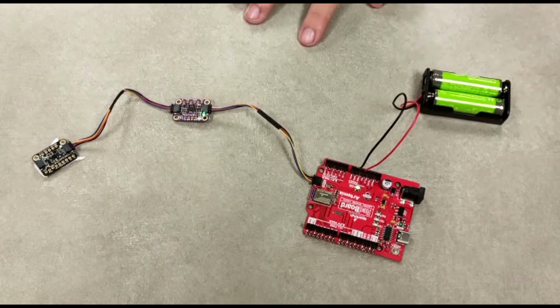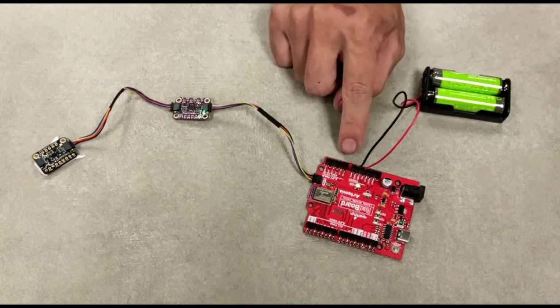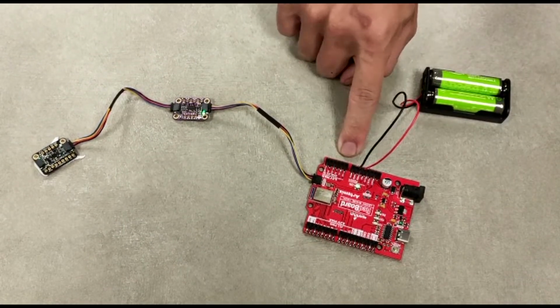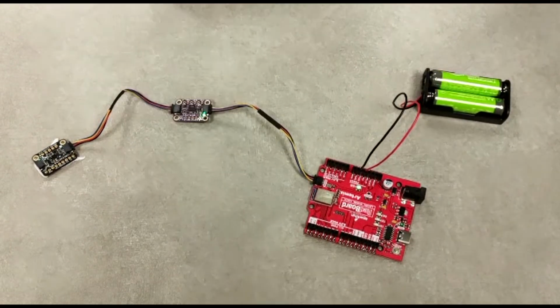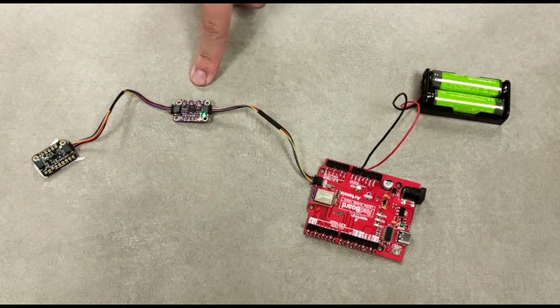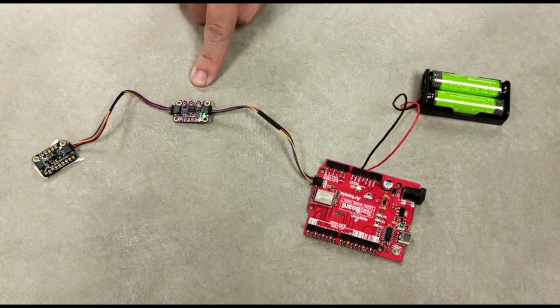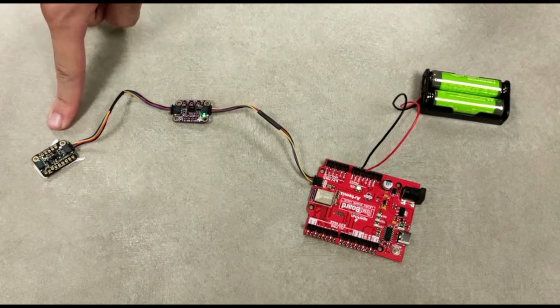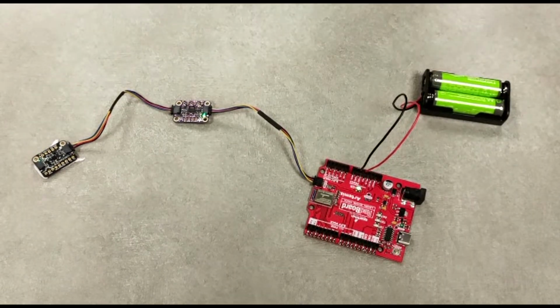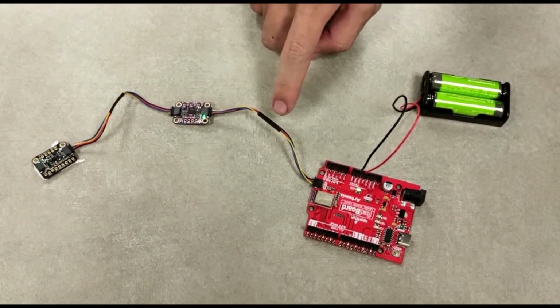So there are three components in our prototype. This is our microcontroller, and we're using Redboard Artemis, and it has a Bluetooth module in it right here. And this is our accelerometer, and we're using ADXL375. And this is our gyroscope, and we're using ISM330. And between the components, we're using Quick Connector.